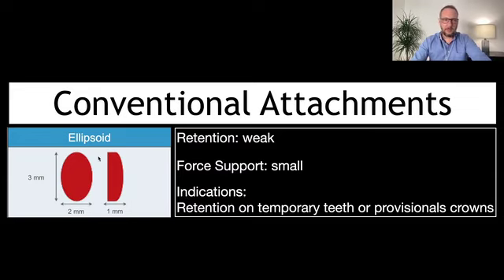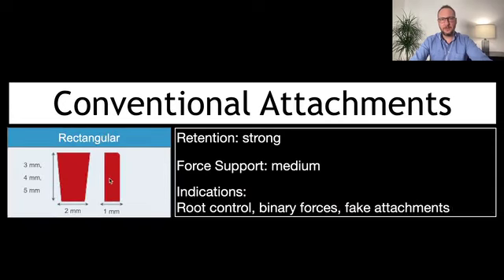For young patients in mixed dentition, when it's completely possible for us to treat them with aligners, but we sometimes have very short crowns and need to improve retention, this kind of attachment is also very useful. But besides these examples, I really prefer the others, right? I think they work better with a better force system, okay?